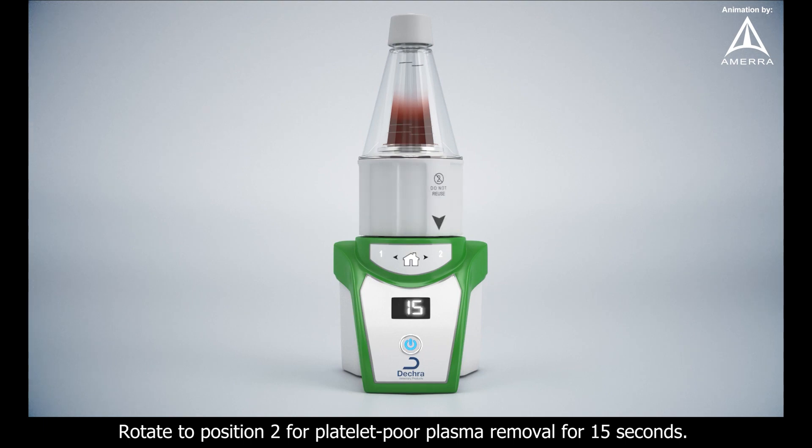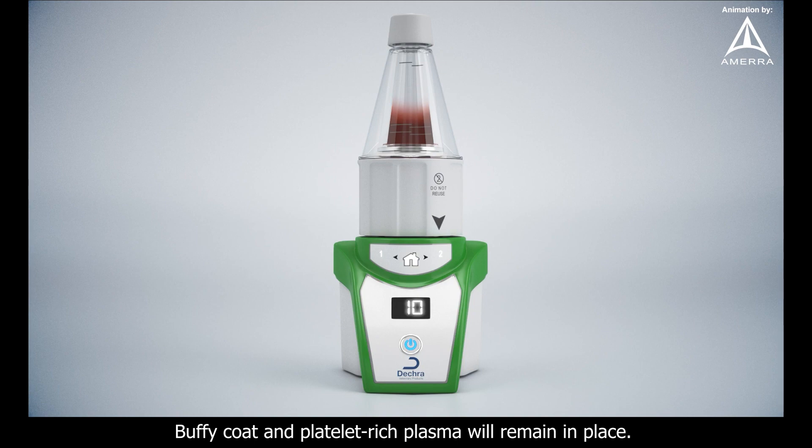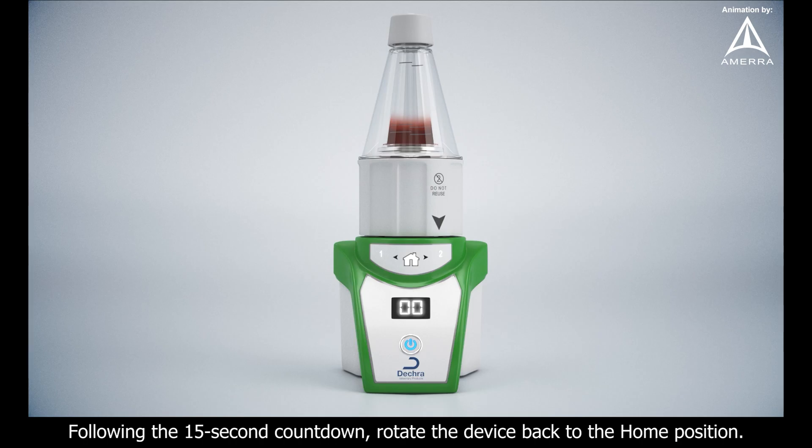Rotate to position 2 for platelet-poor plasma removal for 15 seconds. Buffy coat and platelet-rich plasma will remain in place. Following the 15-second countdown, rotate the device back to the home position.